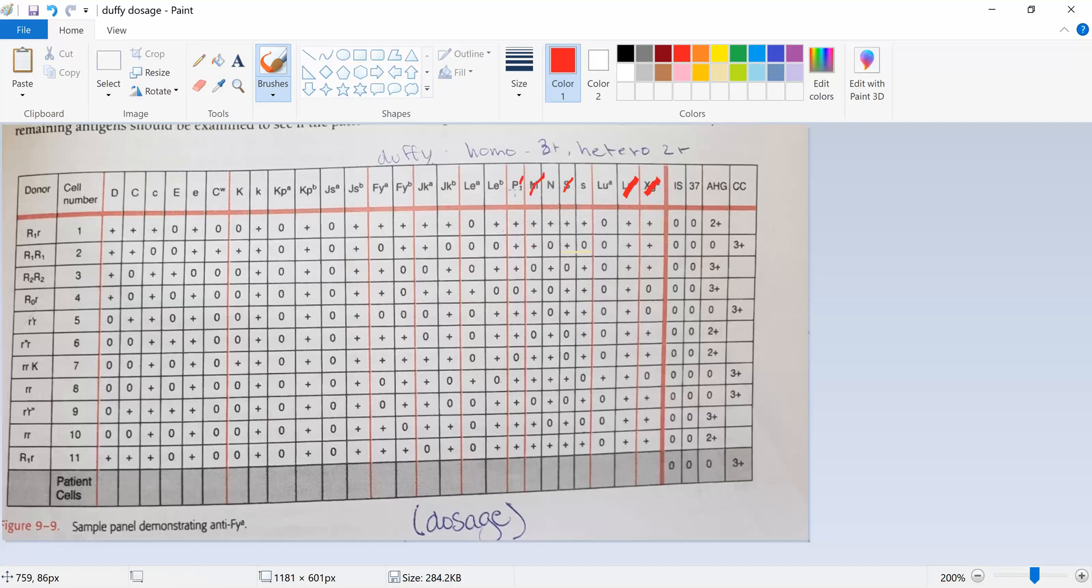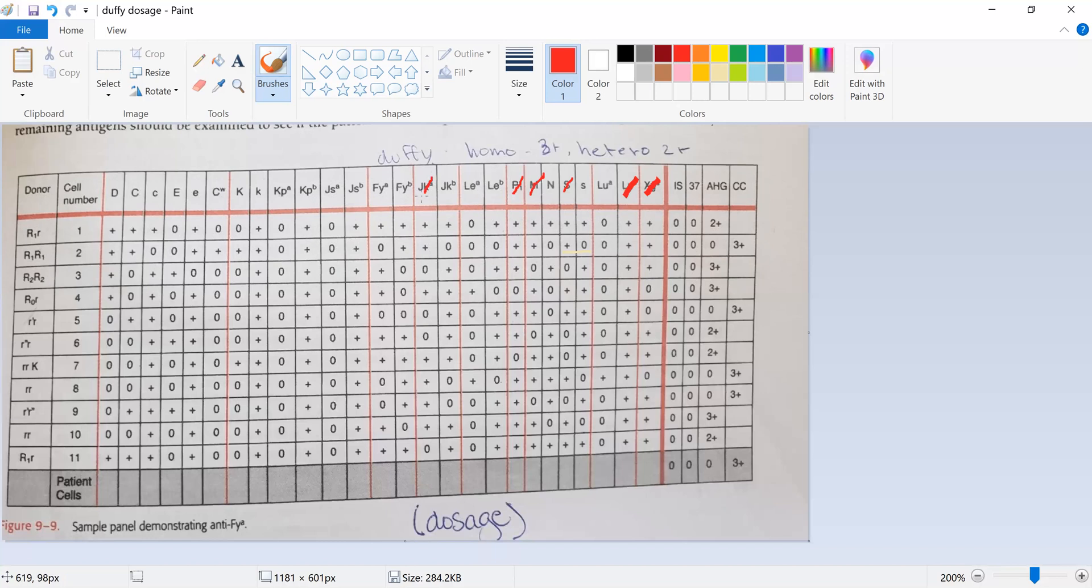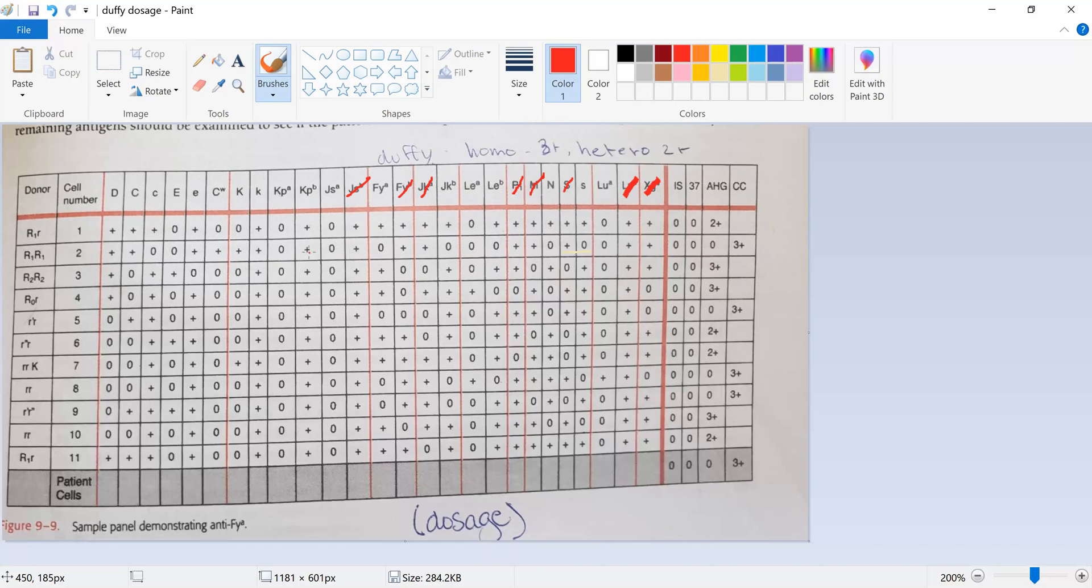P1 is by itself. Now JKA, is that homozygous? Yeah. Yep. And then Duffy B, homozygous or heterozygous? Homozygous, so I can mark off Duffy B. JSB, that's homozygous, so I can mark that one off. KPB, homozygous.